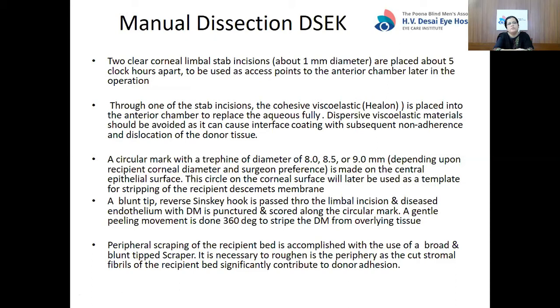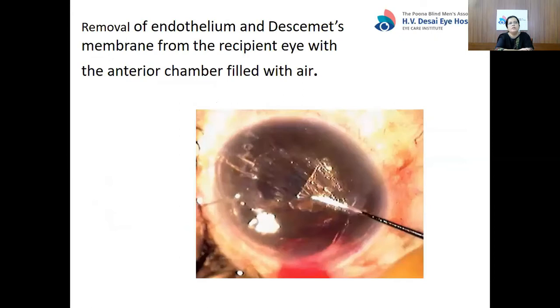A blunt-tip reverse Sinskey hook is passed through the limbal incision and the diseased endothelium with DM is punctured. A circular groove is made first all along 360 degrees, and then with gentle peeling movements, 360-degree peeling of Descemet's membrane from the overlying stroma is done. Peripheral scraping of the recipient bed is accomplished with a broad and blunt scraper. It is necessary to roughen the periphery to cut the stromal fibrils of the recipient bed, as this significantly contributes to donor lenticule adhesion.